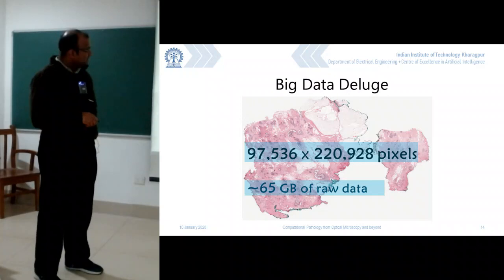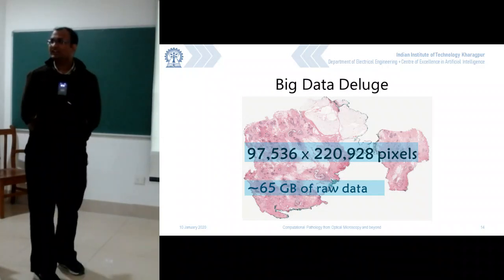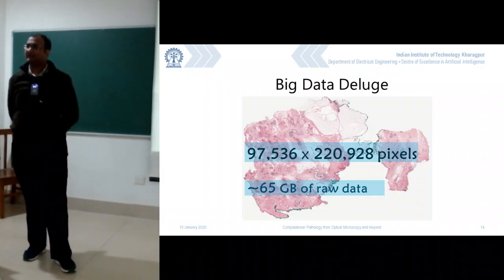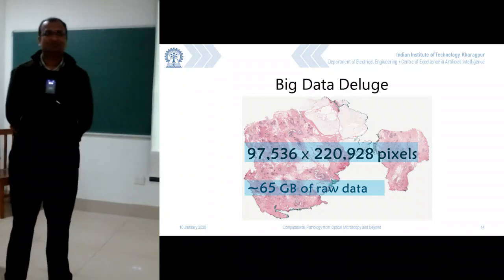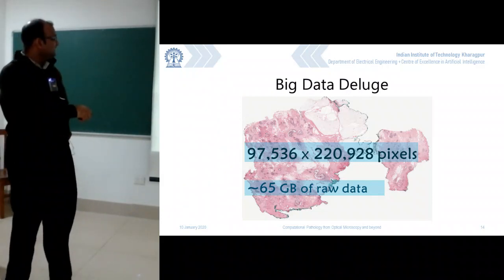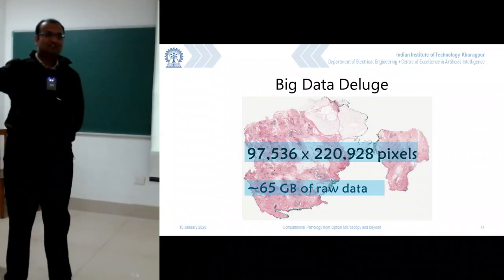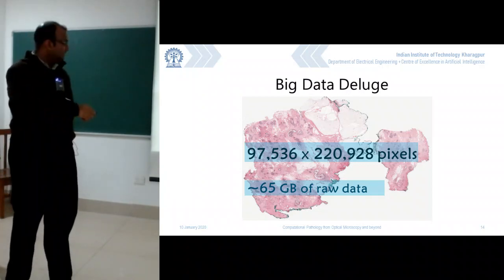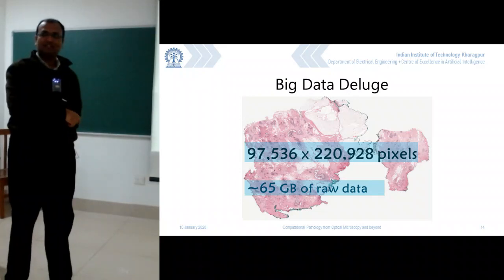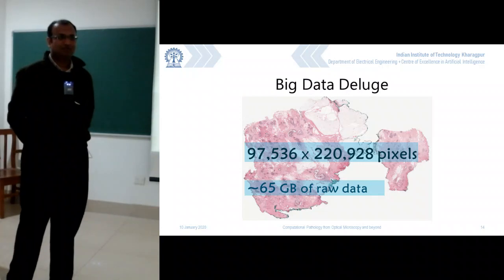Okay. Now look at the file size, that is 65 GB. We are not calling MBs or anything. I mean, it's 65 gigabytes, not bits, bytes. So now imagine, this is like a few thousand times bigger than the largest photograph taken from a camera. Even if you do a panoramic photograph of this classroom, this is a few hundred times larger than that panoramic photograph itself. And that's where all the problem now creeps in.